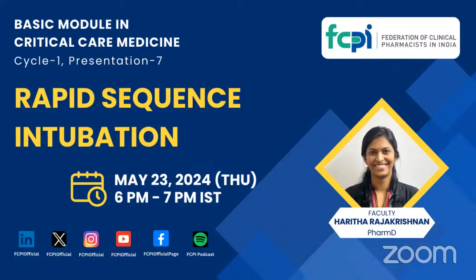This is a technique used to quickly and effectively secure the airway in patients who are at risk of aspiration or are in respiratory distress. It involves the administration of a potent sedative and a paralytic agent to facilitate endotracheal intubation. The goal is to achieve rapid and safe airway control with minimum complications.